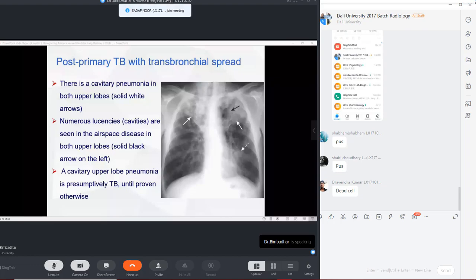Yes, true. So that's the reason this person will have highly productive sputum, and the sputum is yellow in color. Did you get it? So even with the symptom, if a patient is presenting with a chronic productive sputum, I should be expecting to see cavities in the X-ray. Did you get it? I should be expecting so much consolidation and interstitial change in this patient. Yes, did you understand how I am relating his symptoms to the expected radiographic features and how I am actually making out the staging of this disease?